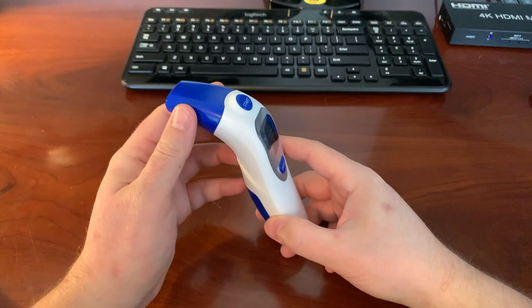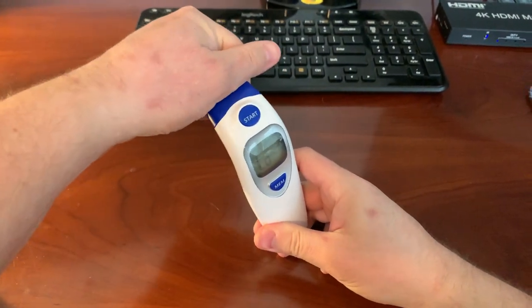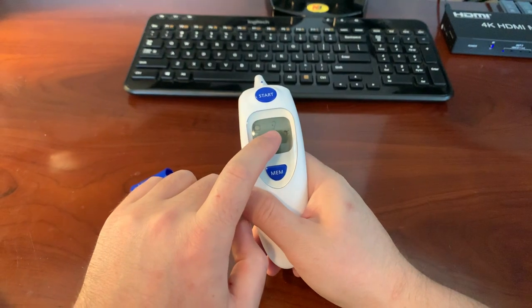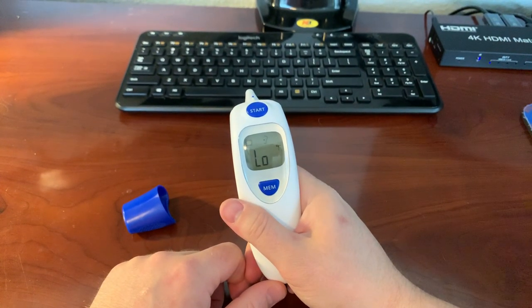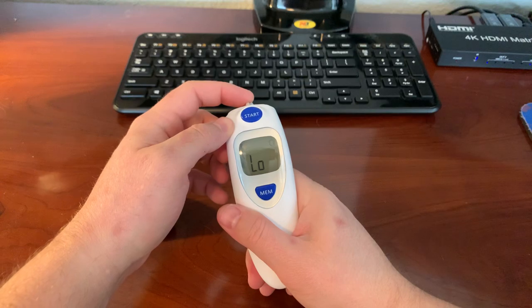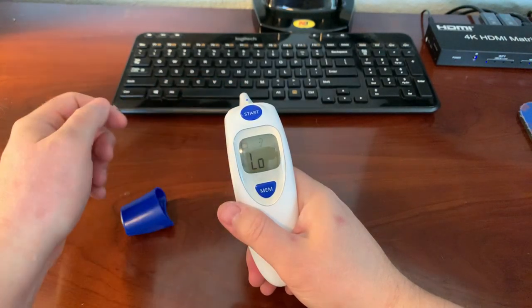Also a note: right now this is set up for a forehead measurement. If you want to do an ear measurement, it'll automatically tell you with a little symbol that it's set for an ear. It uses a little switch — when it's depressed it's for a forehead, when it's not depressed it's for an ear.